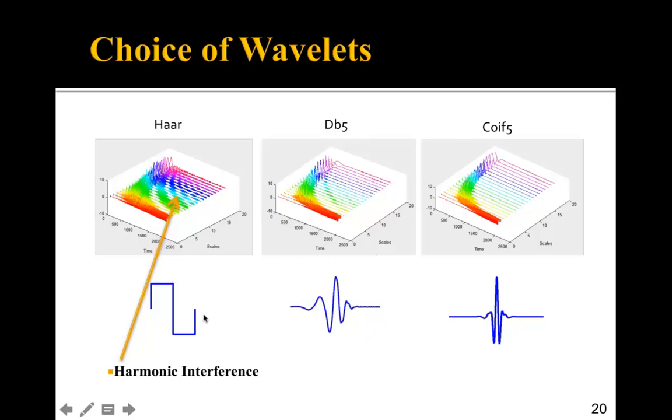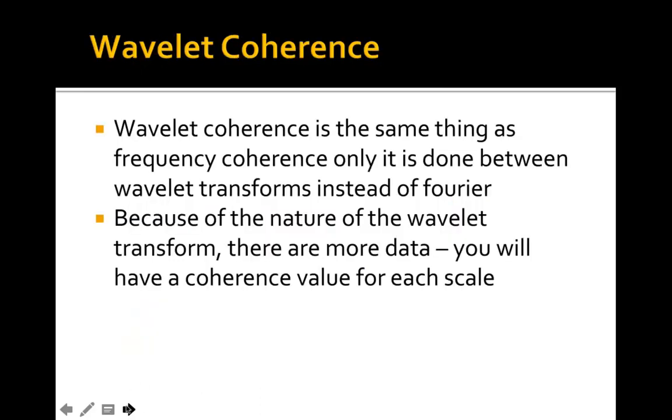So this one is super easy to use, but you can see you get these weird ripple effects, and that's artifactual, that's not real. You get a few of them with this one, not so many with this one. So that's just some different illustrations.